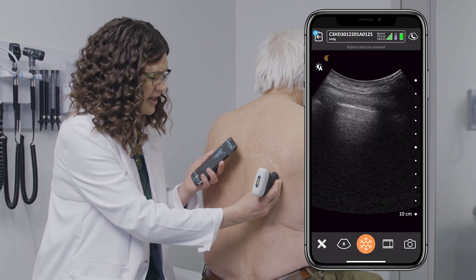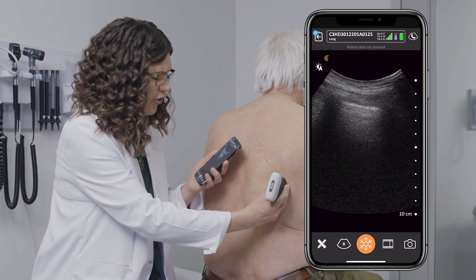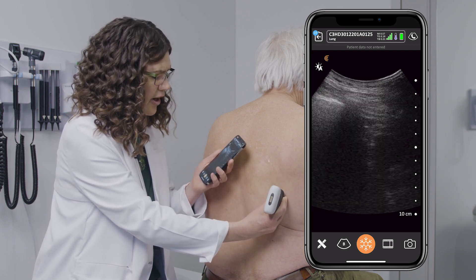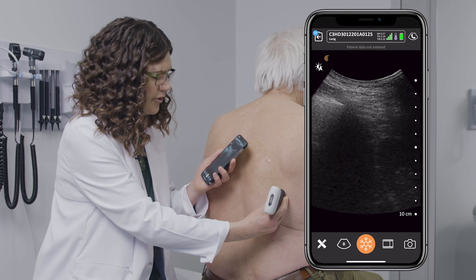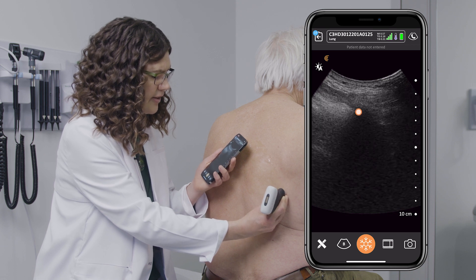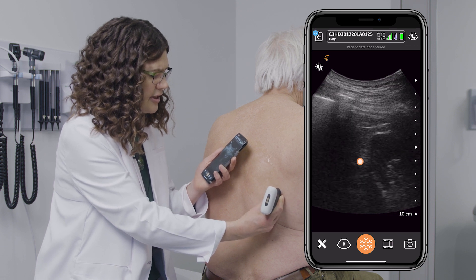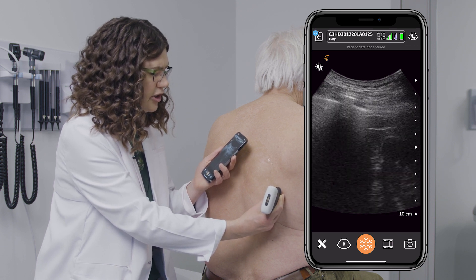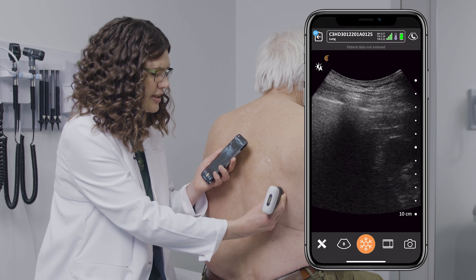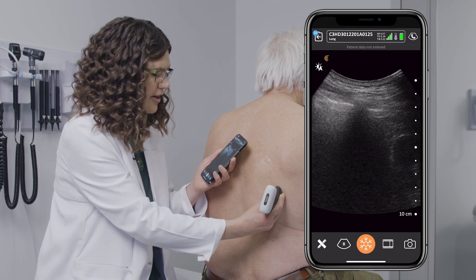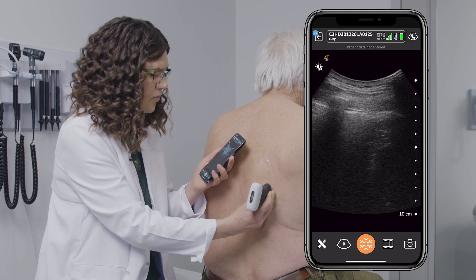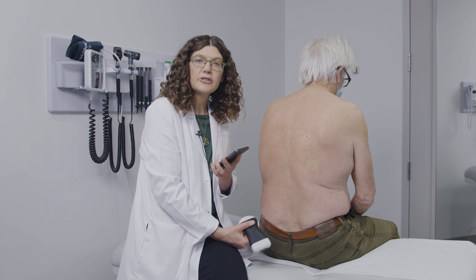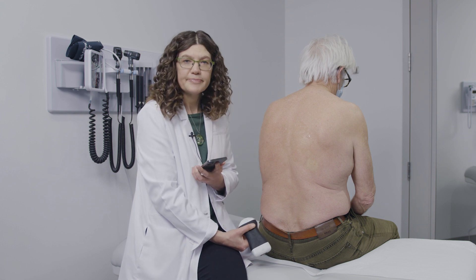I continue my scan all the way to the bottom, where I start to see where the lung meets the liver. This is called the physiological liver-lung point, and you can see it on my screen here. This concludes the lung exam.